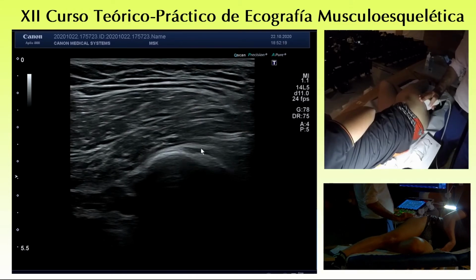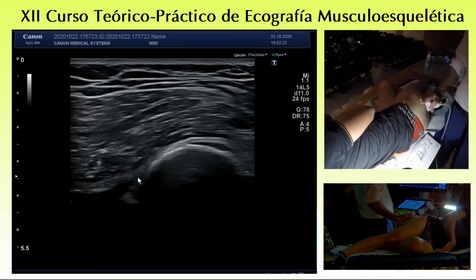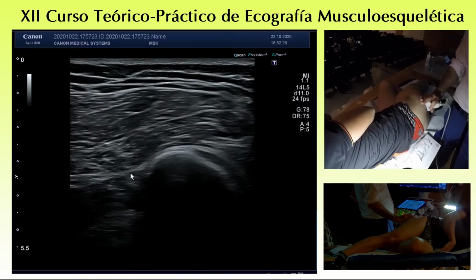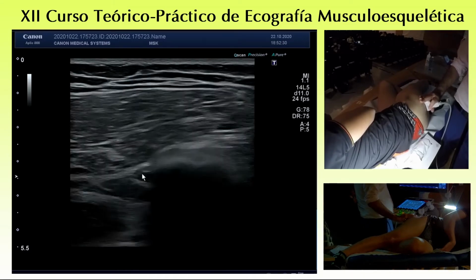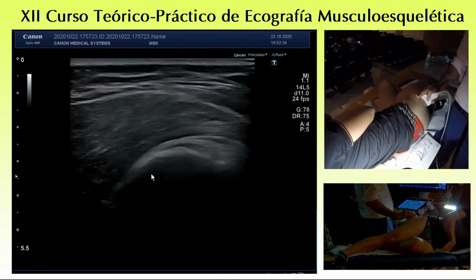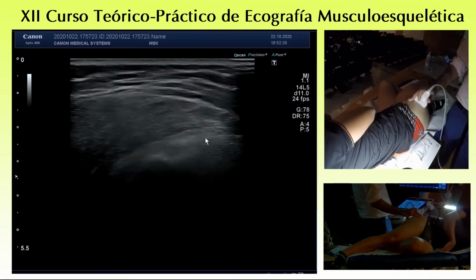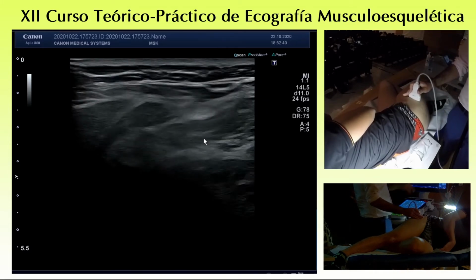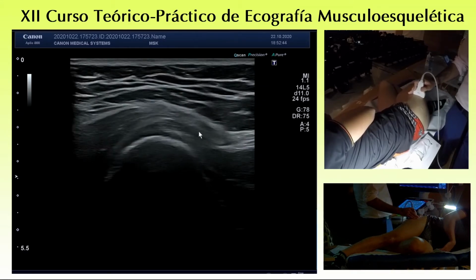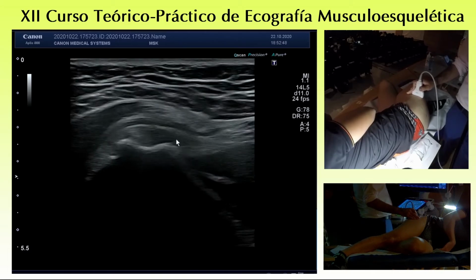So when there is no big trochanteric bursa distension, just look to the posterior aspect to see if some fluid or synovium collects on the posterior side of the trochanter. That's all for the lateral hip, because regarding the fascia I already talked before, and the possible impingement, possible snapping over the trochanter.